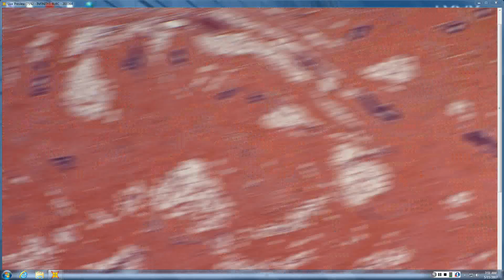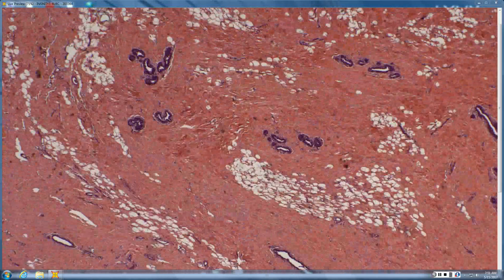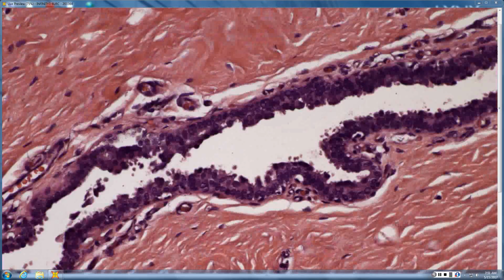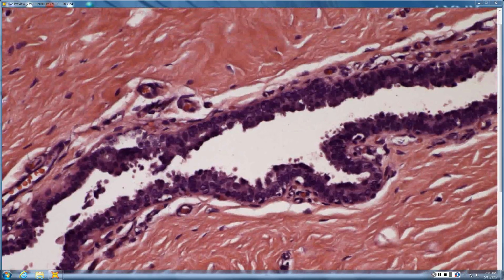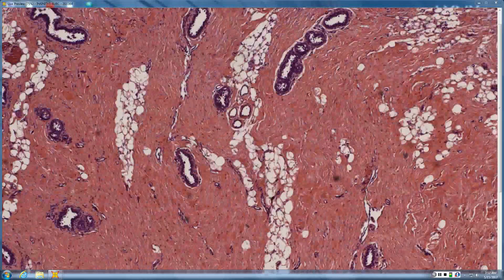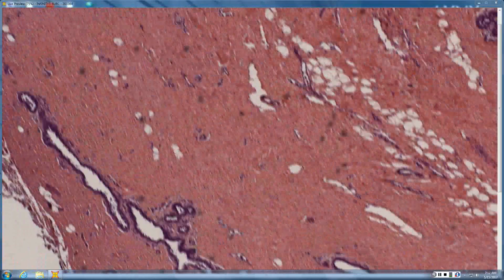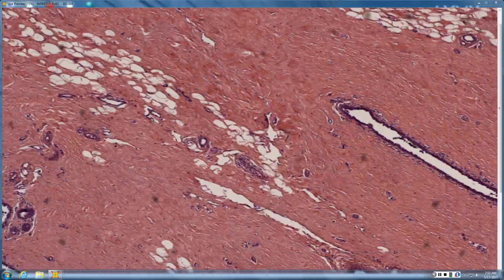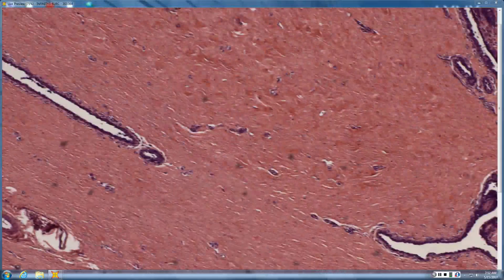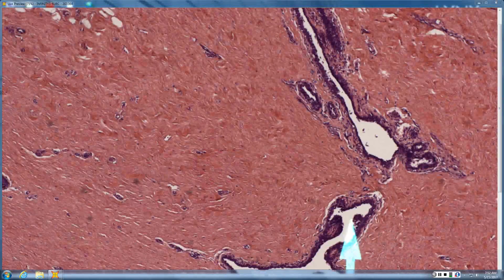Right, so I've got this dense pink stromal thing in the dermis with these glandular-like structures. The nuclei look pretty dark and crowded, so I'm thinking probably some sort of adenocarcinoma. We're certainly in that chapter, and it's glandular. They stain a little dark, I have to say, but the glands themselves are not so crowded. They're not jumbled. I don't see any Roman arches or anything of that sort. Although maybe now that I said that, maybe it's trying right there.